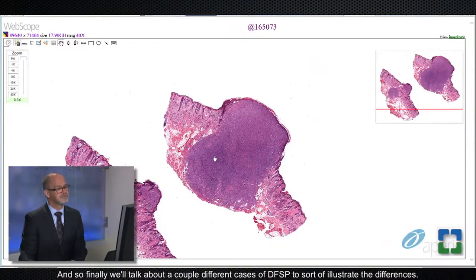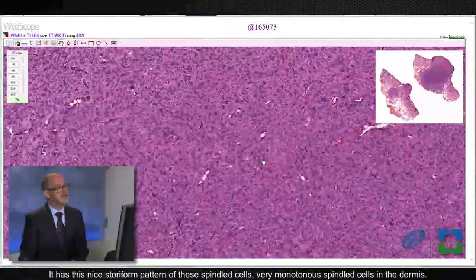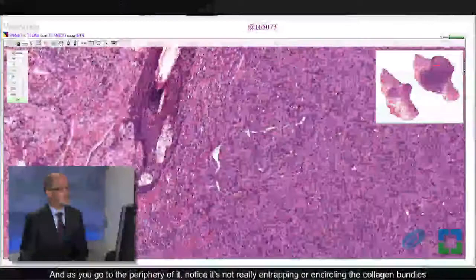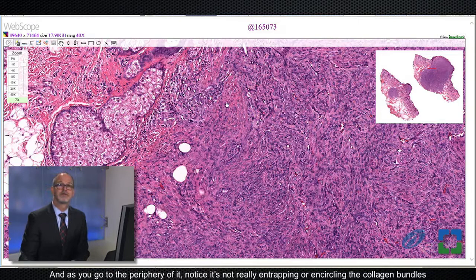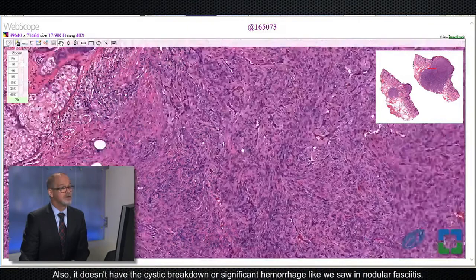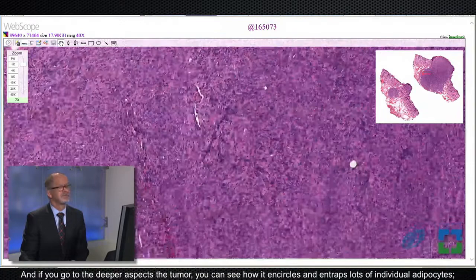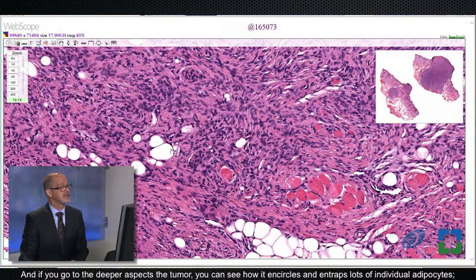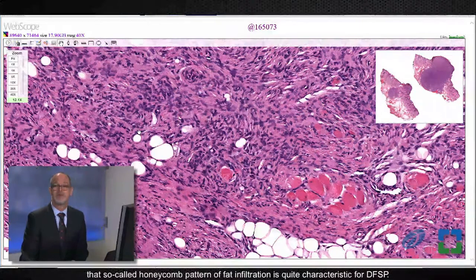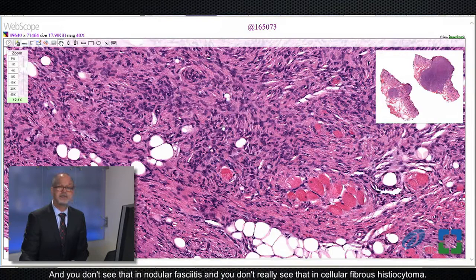Finally we'll talk about a couple of cases of DFSP to illustrate the differences. Here's a case of DFSP — it has this nice storiform pattern of very monotonous spindled cells in the dermis. As you go to the periphery, notice it's not really entrapping or encircling the collagen bundles of the reticular dermis like we see in cellular fibrous histiocytoma. Also, it doesn't have the cystic breakdown or significant hemorrhage like we saw in nodular fasciitis. And if you go to the deeper aspects of the tumor, you can see how it encircles and entraps lots of individual adipocytes. That so-called honeycomb pattern of fat infiltration is quite characteristic for DFSP, and you don't see that in nodular fasciitis or in cellular fibrous histiocytoma.